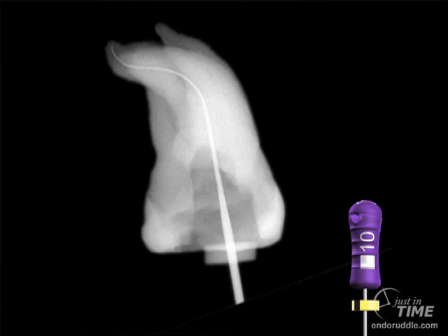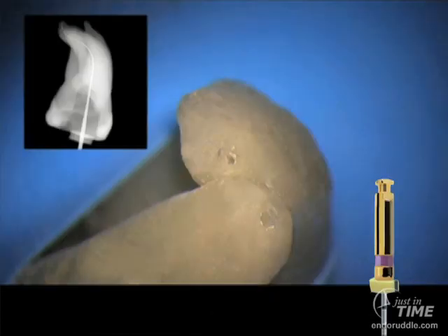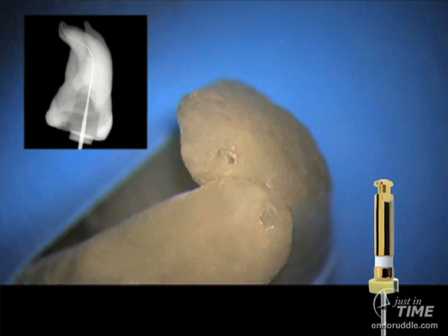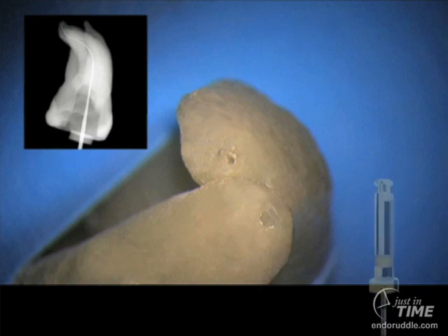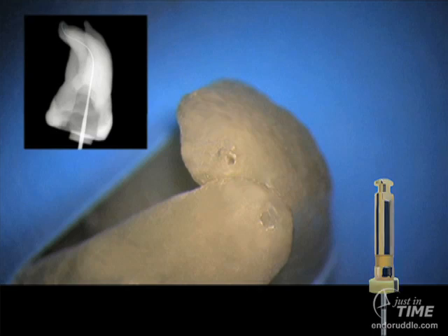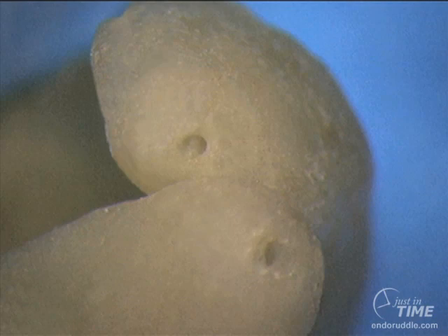This file is making a 90-degree turn roughly at the more coronal curvature, and apically it's about another 90-degree curvature relative to the first. It would take a long time to work a 15 file down to that length. Watch carefully: you'll notice the first 13 emerging at the foramen. The white instrument is not engaging dentin towards its terminal extent — it's cutting more away from length. Finally when we get to the 19, it's cutting at length, intentionally through the foramen with no transportation. Notice the apical foramen is perfectly round with no ripping or tearing — this is pretty exciting.